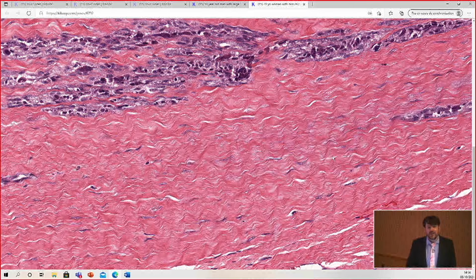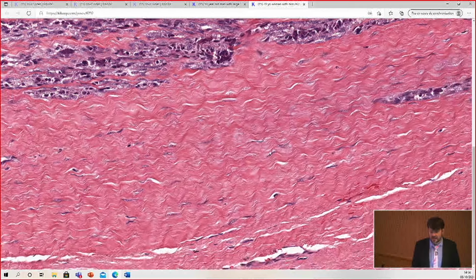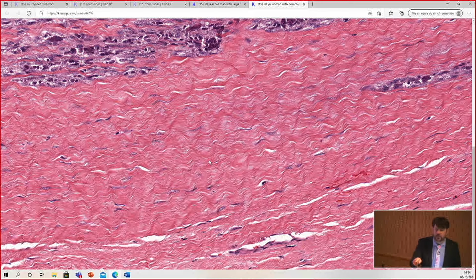Noodles. They're wavy, right? Really wavy when they're dried. And then you add the hot water, and then they get soft. One of my fellows, Dr. Ed Fulton, a really awesome fellow of mine in the past, a trainee in dermatopathology, said it looks like ramen noodles in the package, how wavy. When it's that wavy, it's usually not nerve. It's usually collagen, dense regular connective tissue.